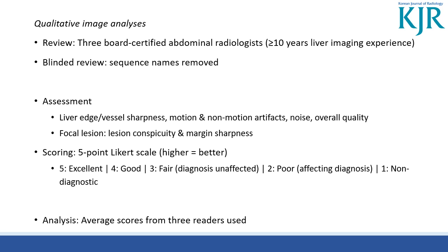Liver edge, vessel sharpness, motion and non-motion artifacts, image noise, and overall image quality were rated on a 5-point Likert scale with higher scores indicating better quality. The conspicuity and margin sharpness of focal lesions were assessed using the same scoring system. The average scores of the 3 readers were used for further analysis.